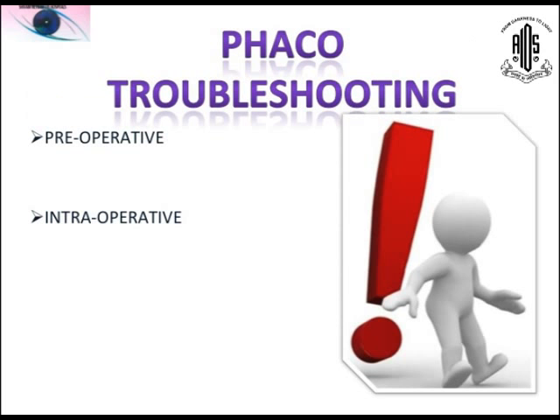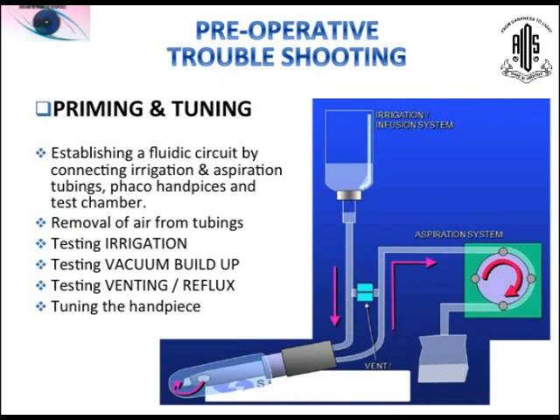So let's come to the PHACO troubleshooting. Starting with the pre-operative, and then we go to the intra-operative. What are the pre-operative steps? Even though your scrub nurse may be preparing the PHACO machine, the priming and tuning is the most important aspect before you start your PHACO surgery.